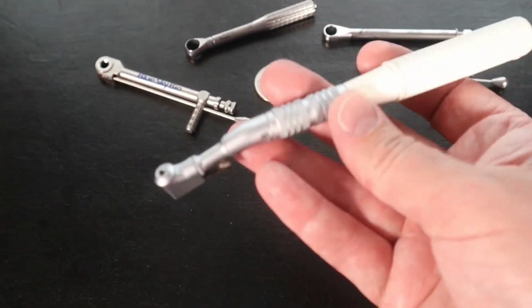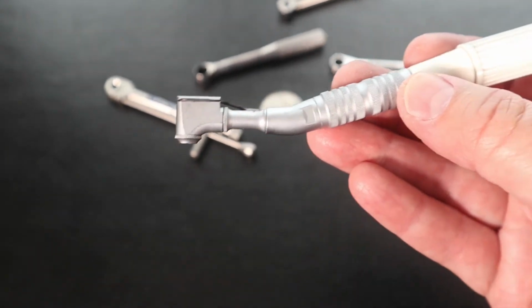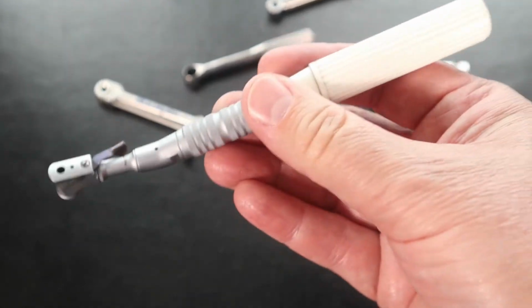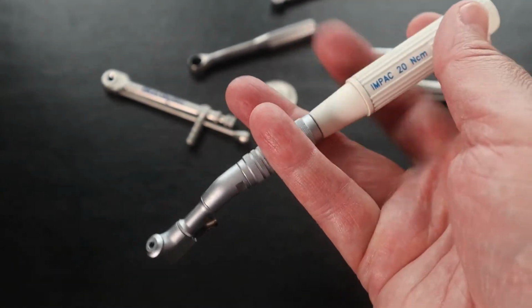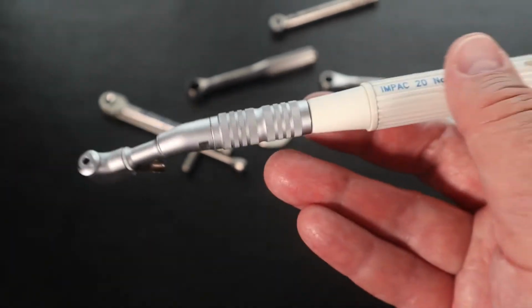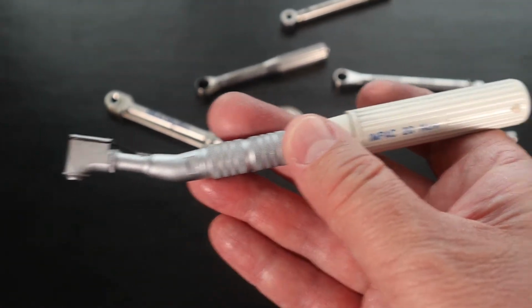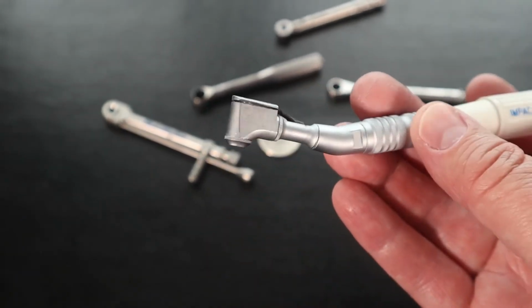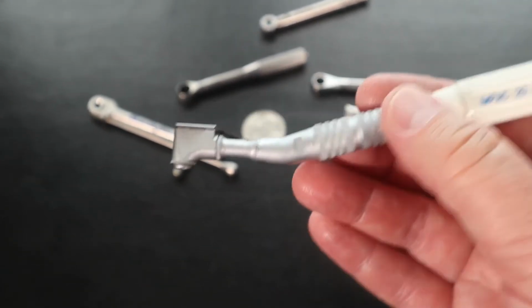This model down here helps you access back teeth. Put the bit in here, the driver, and then you place it on the screw in the implant, and then you just twist this. This is set for 20 Newton centimeters. This one's pretty old. I think this one dates from maybe the late 80s. I don't use this one very often at all. But every now and then, if it's a hard to reach implant, it comes in handy.